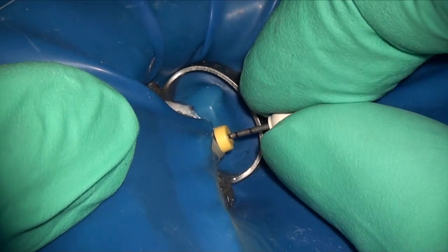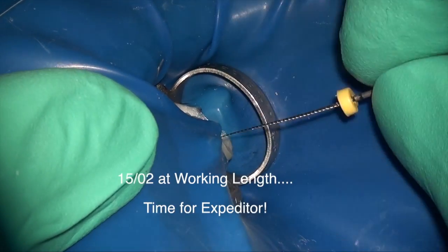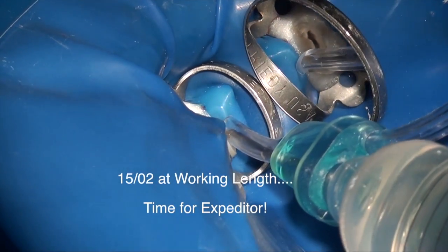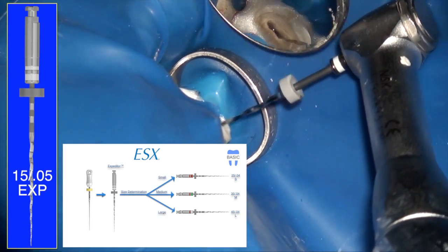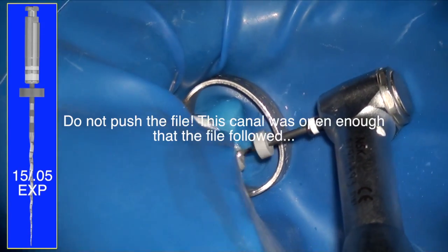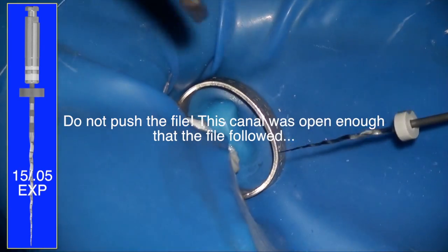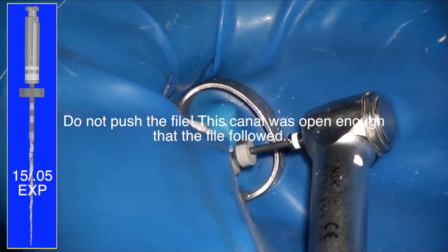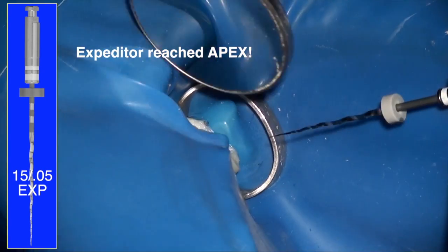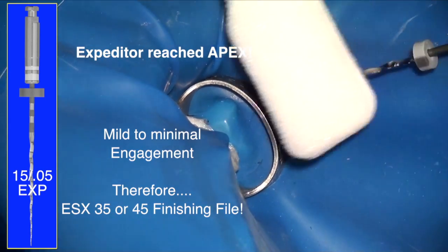So what I'm going to do now is instrument both of those to a size 15/02 hand file, and now it's time to use the expediter. If you recall, the protocol for the ESX was to get a 15/02 canal and then use the expediter with a single stroking clean. And you can see here on the palatal canal, right after the first stroke, we got all the way down to the apex using the expediter. So one or two strokes here, and we were already using the expediter to the apex.